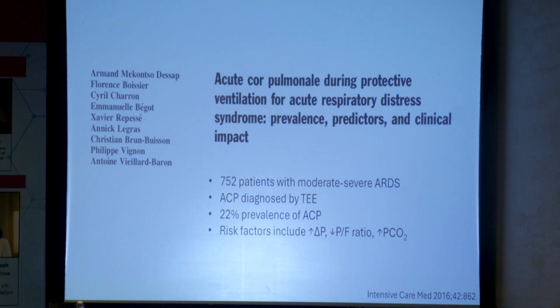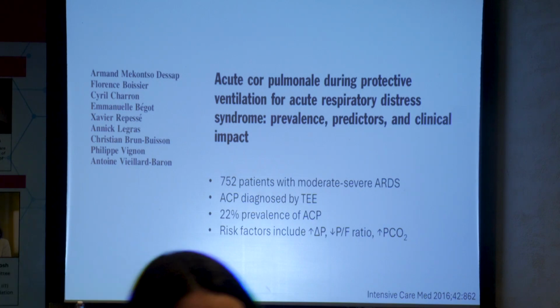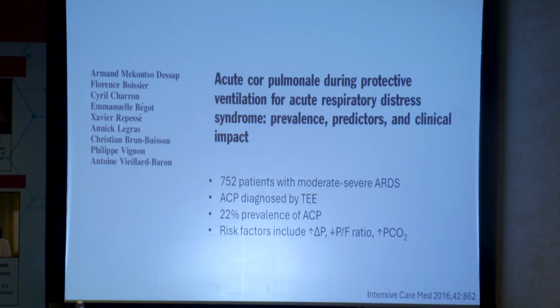We commonly will change that over a wire to an ECMO cannula. In general, we don't like changing lines over wires if you can avoid it for infectious reasons, but if you have an indwelling line, the benefit of using that for cannulation, if there is not a big thrombosis, is higher than the risk of removing it and doing another stick.